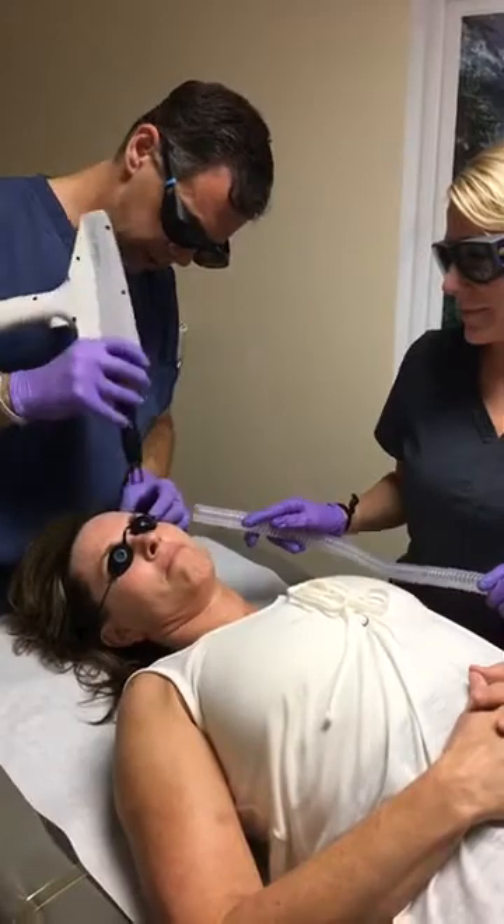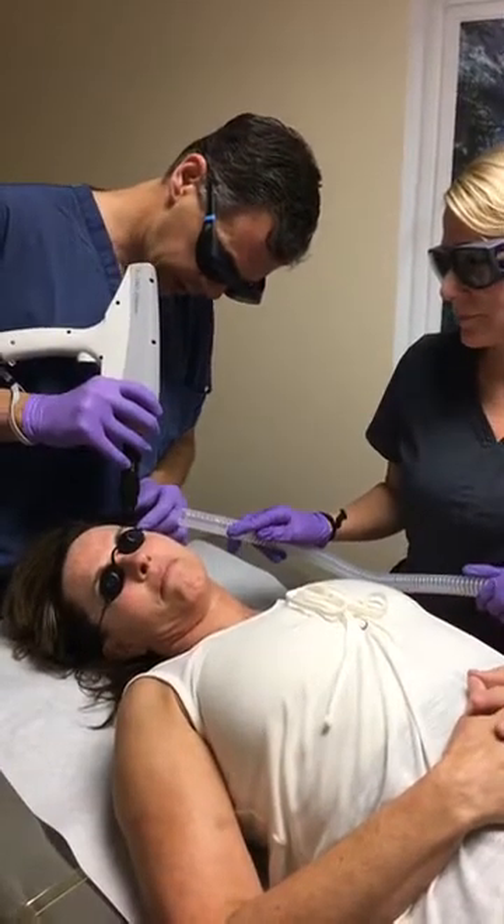We are going to show them how to help lock in the moisture. That skin is peeling.